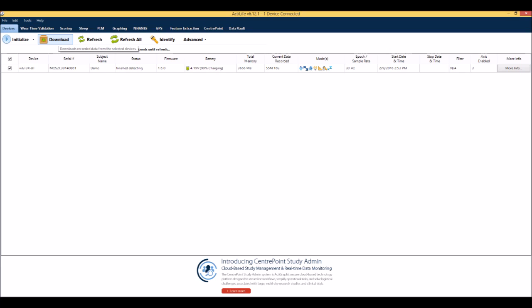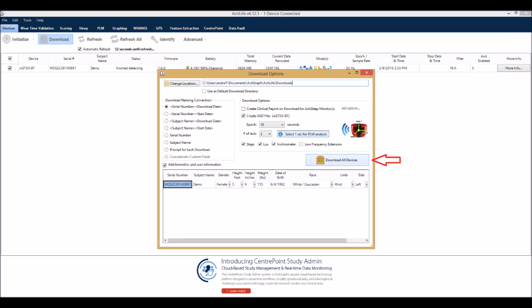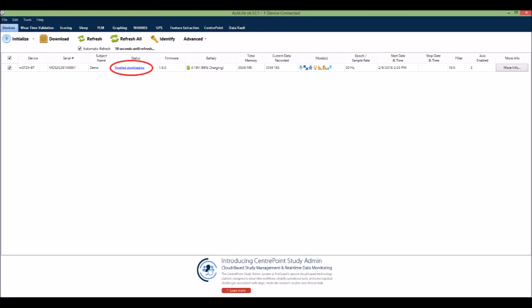This will open a dialog box that will display the download options. Here you will want to select the file download location, name the file, and edit the user information. Once the download options are selected, click Download All Devices. When the download is complete, a finished downloading link will appear. The data has now been successfully downloaded and can be scored using the analysis tools in ActiLife.